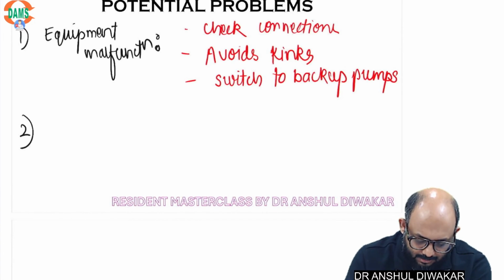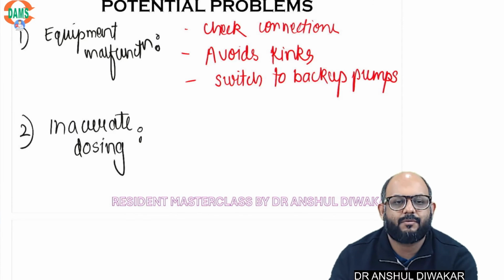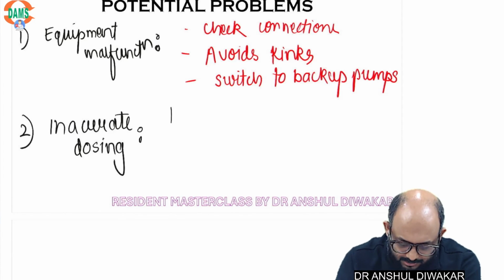Then you can have inaccurate dosing. So double check your inputs always.